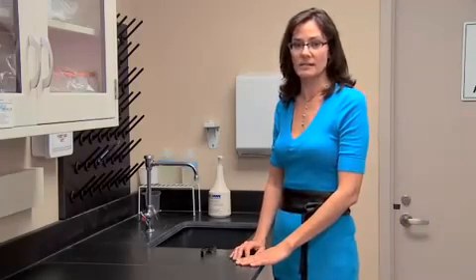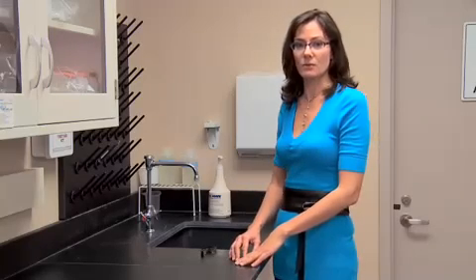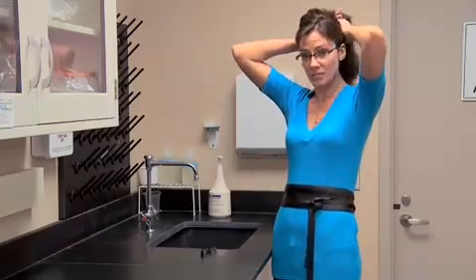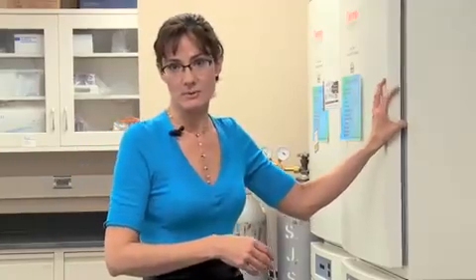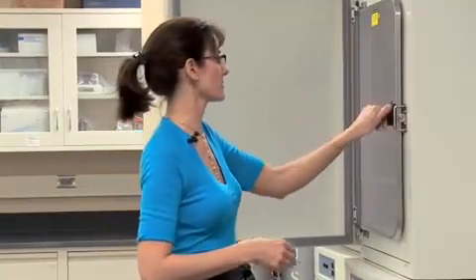As we will be entering a fairly aseptic area and we don't want to introduce any extra microorganisms, we follow some simple guidelines, such as removing all rings, watches, bracelets, and pulling back long hair, pushing up our sleeves, and washing our hands. I've checked my cultures today and saw that the cells were very crowded on the tissue culture dish. So what I'm going to do is move some of these cells to a new dish.